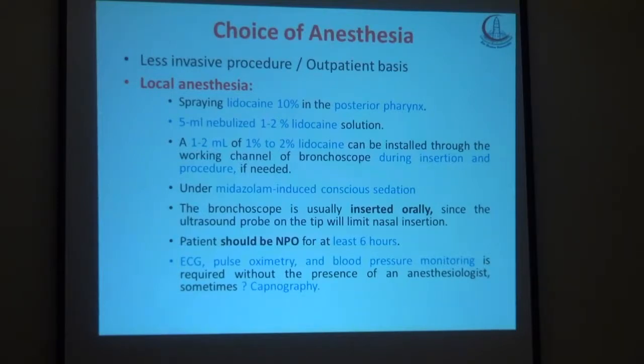وتاني حاجة واحنا شغالين بنبقى نعمل مونيتورنج للبالس أوكسيمتر والاي سي جي والبلاد بريشر مونيتورنج، صراحة يعني مكتوب في الليترتشر، لكن احنا ما بنعملش حتى في اللوكال بلاد بريشر مونيتورنج أثناءه. ويمكن عملنا استدي على البرونكوسكوبي العادي أنا والدكتور عماد على حكاية البلاد بريشر والاي سي جي في البرونكوسكوبي العادي، إن احنا نعمل مونيتورنج للعيانين ونشوف إيه اللي بيستفاد. ده بينفع بس الناس اللي عندهم كاردياك هيستري، لكن الناس اللي ما عندهمش كاردياك هيستري ما بتفرقش إنك تشوف له الاي سي جي مونيتورنج أو البلاد بريشر مونيتورنج. الأفضل إنك تعملها في الناس دي.